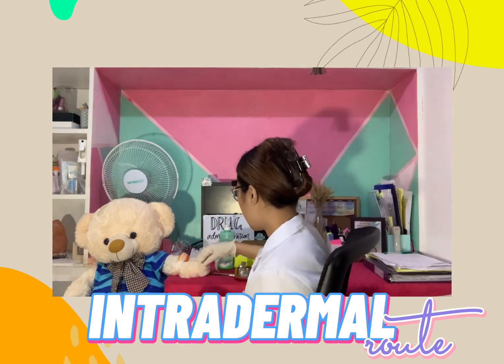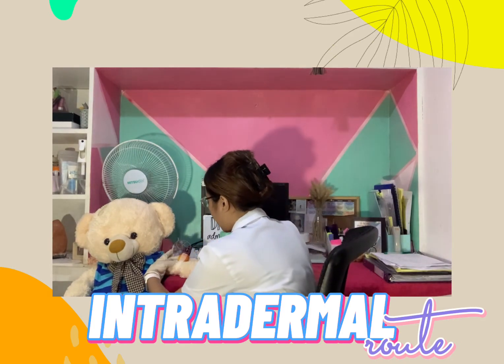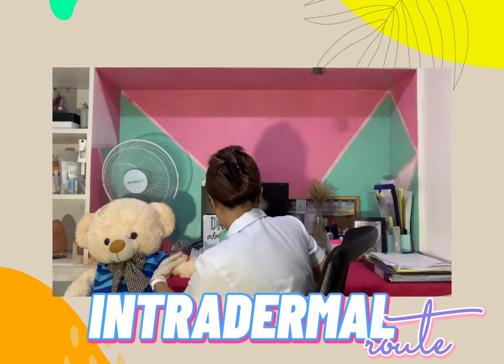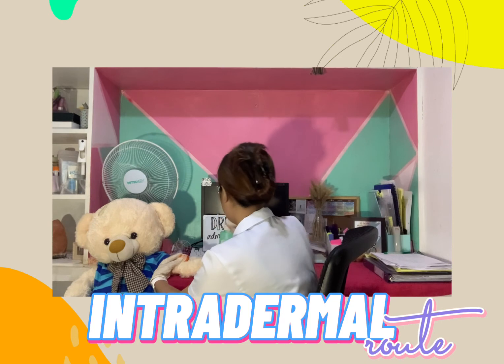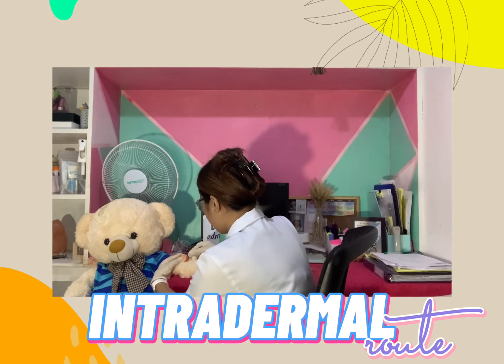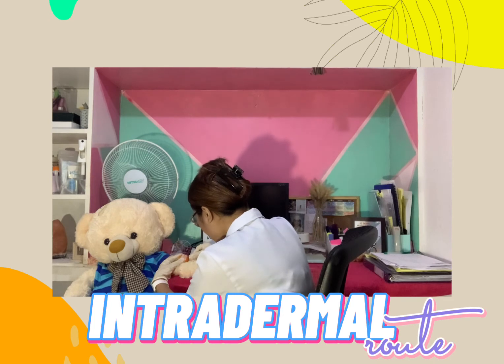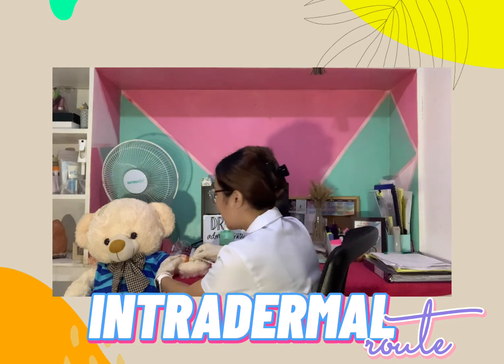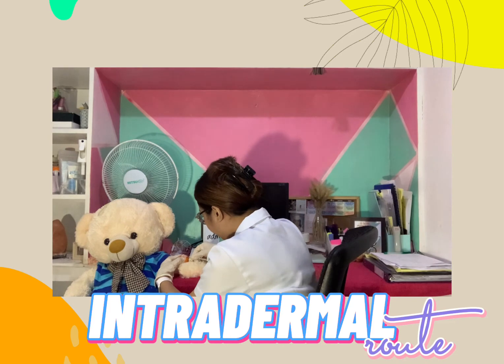Here, by the use of our dominant hand, we will start the skin test on our patient. We will remove the cap of the syringe. By the use of our non-dominant hand, we will position the syringe into bevel up position, and then we will insert it at approximately a 10 to 15 degree angle.